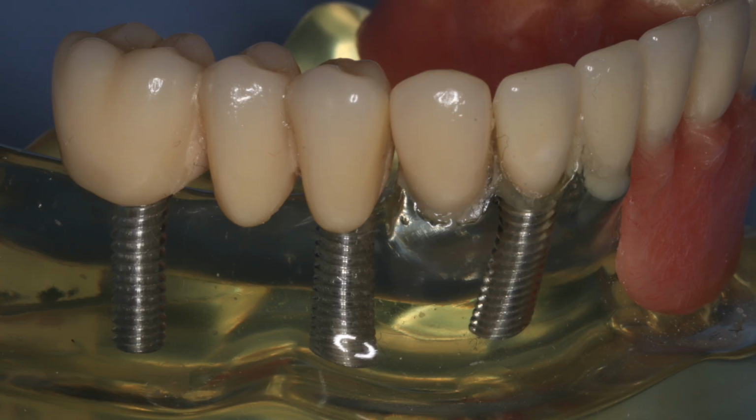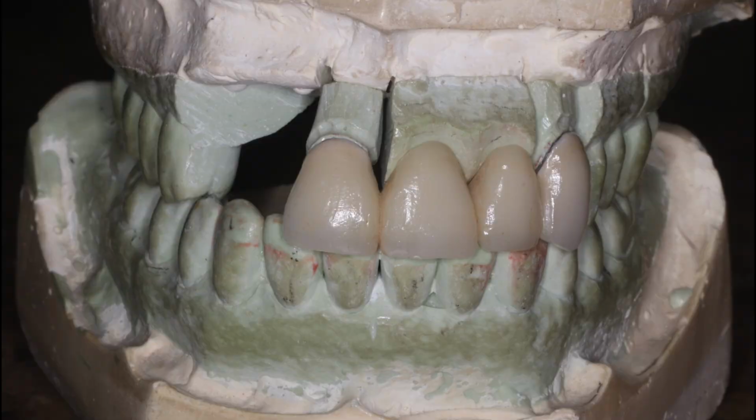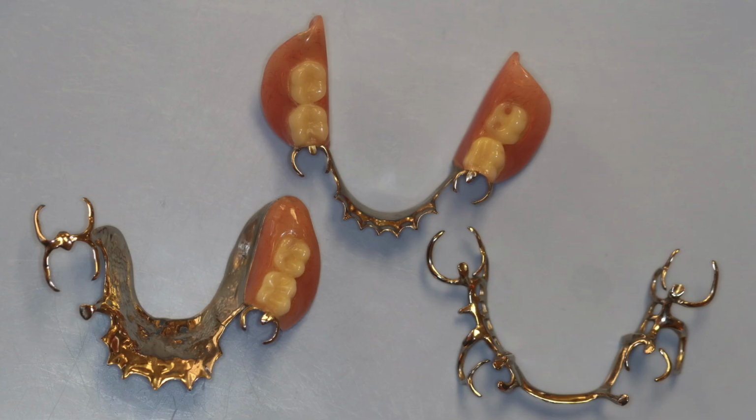Hello, let's talk about implants. An implant is a way to replace a missing tooth. Now, what are your options if you have a missing tooth? Well, you can leave the space vacant, you can place an implant, you can place a fixed bridge, or you can place a removable partial.